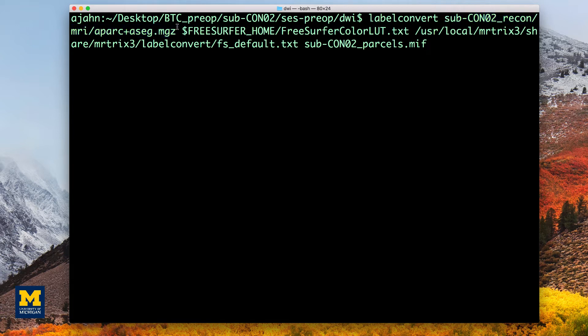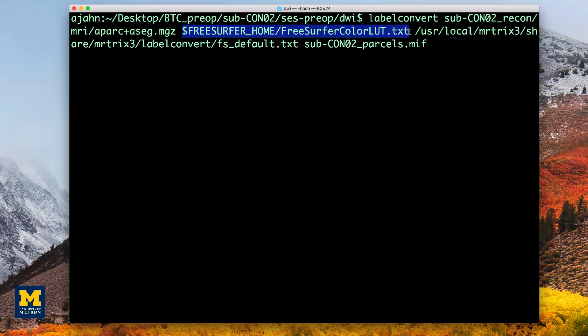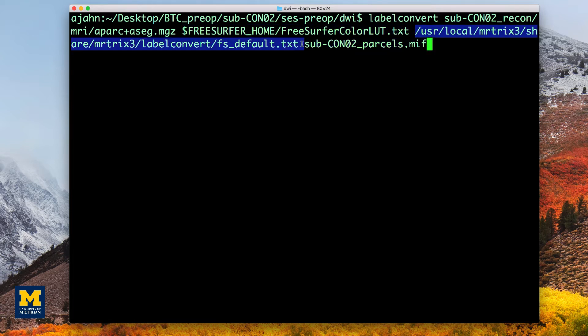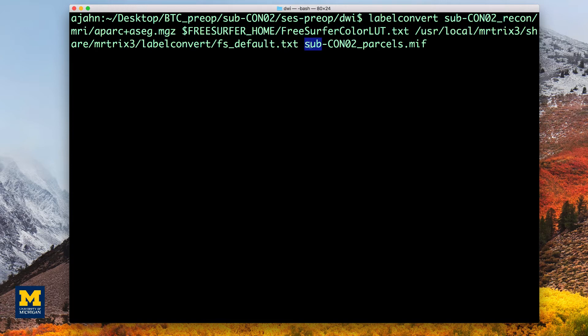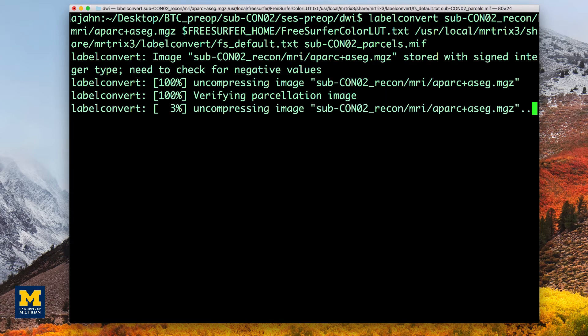The command then uses the FreeSurfer lookup table for the default Desikan-Killiany atlas and converts it to a new table, which can be read by MRtrix. And we then label the output sub-CON02_parcels.mif. This will only take a few moments to run.